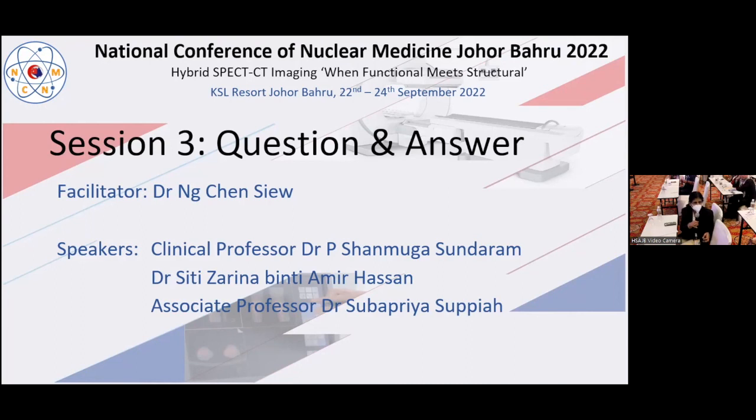What about those who have normal creatinine, but have thyroid disease? A 1-hour delayed image is for patients with concomitant thyroid problems, and a 4-hour delayed image is for patients with chronic kidney disease.